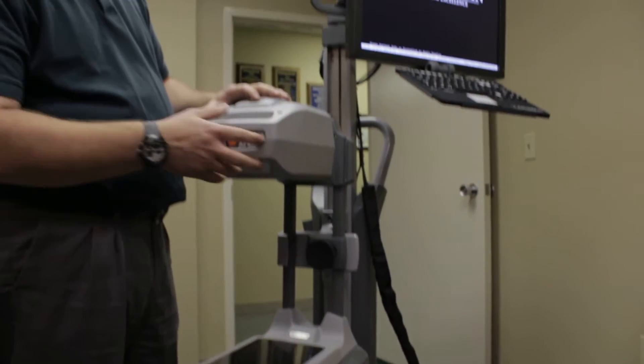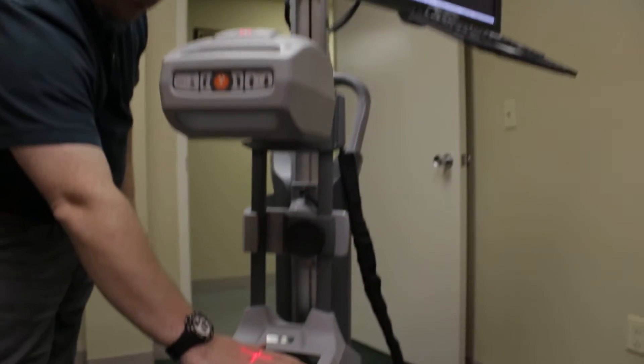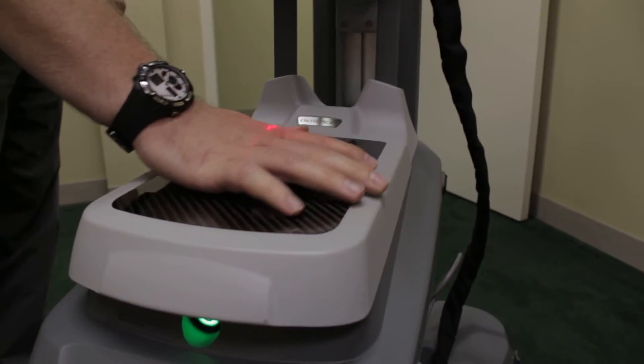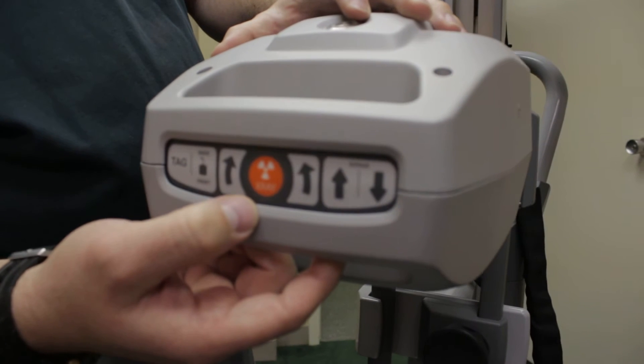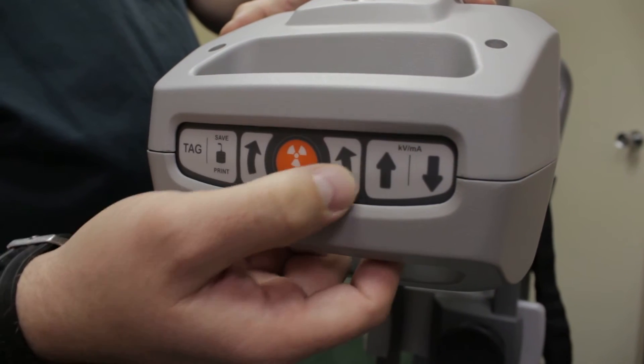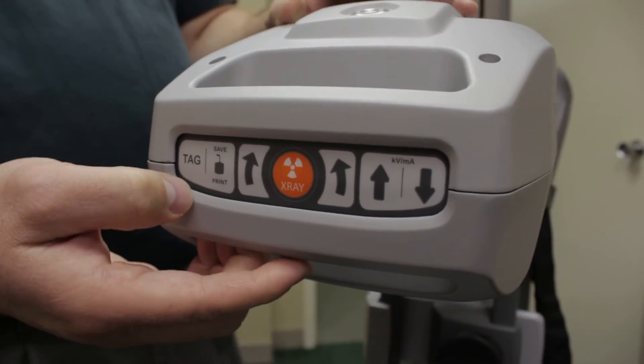It has sterile field controls, also called head controls. You also have a laser targeting guide which is perfect for getting that accurate shot. On the sterile or head controls, we have the dose button, image rotating, the ability to adjust the dose, and the ability to save and tag images.